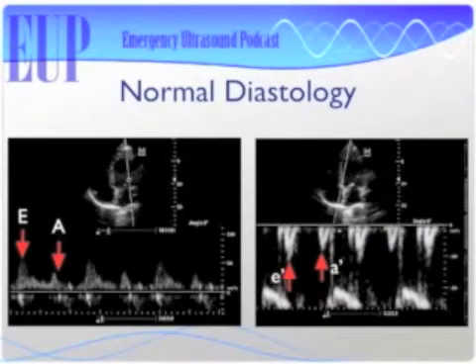10. 5. What was the equation again? Just E prime divided by... E divided by E prime. Okay. So wedge pressure is... 50 divided by 10. It's pretty complicated. Yeah, come on, let me get out my calculator.